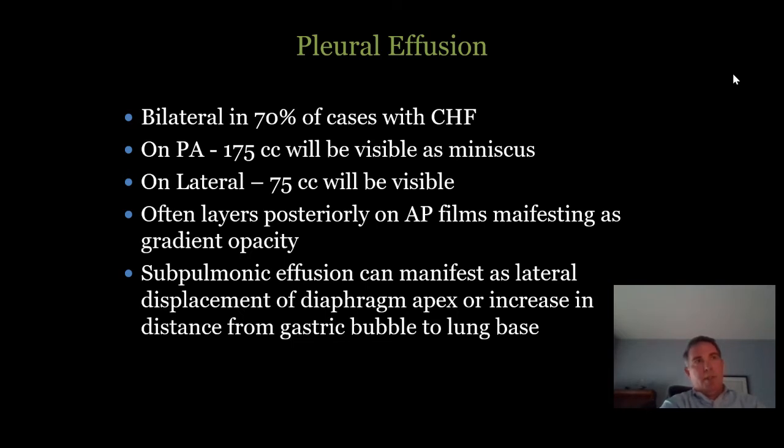on an ICU patient that has effusions and look at the same day x-ray, it makes you feel bad about yourself. Keep that in mind because they often just run up their back and layer posteriorly. You can identify that as a layering gradient, but when you're reading ICU films, use what you have. Use the abdominal CT that was done a day or two ago. Use the chest CT or the head and neck CT. Don't make it harder than it has to be.